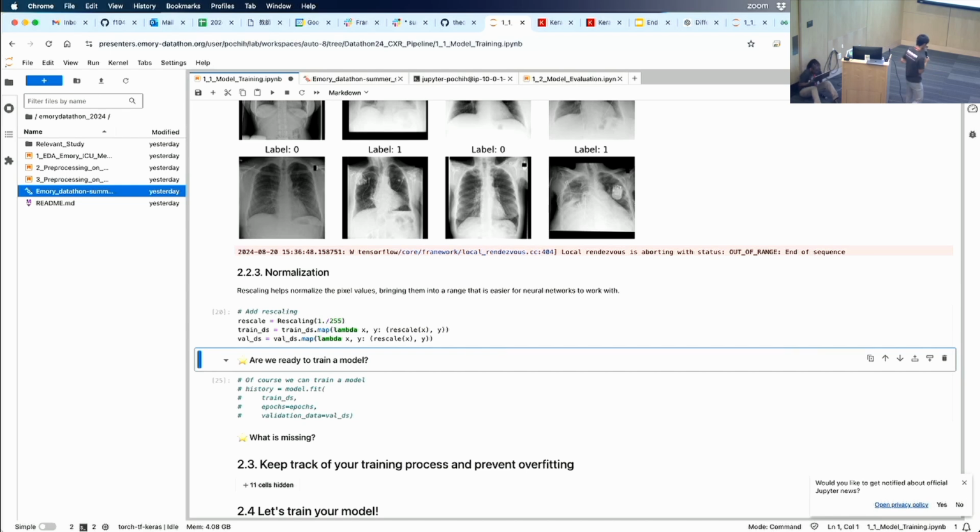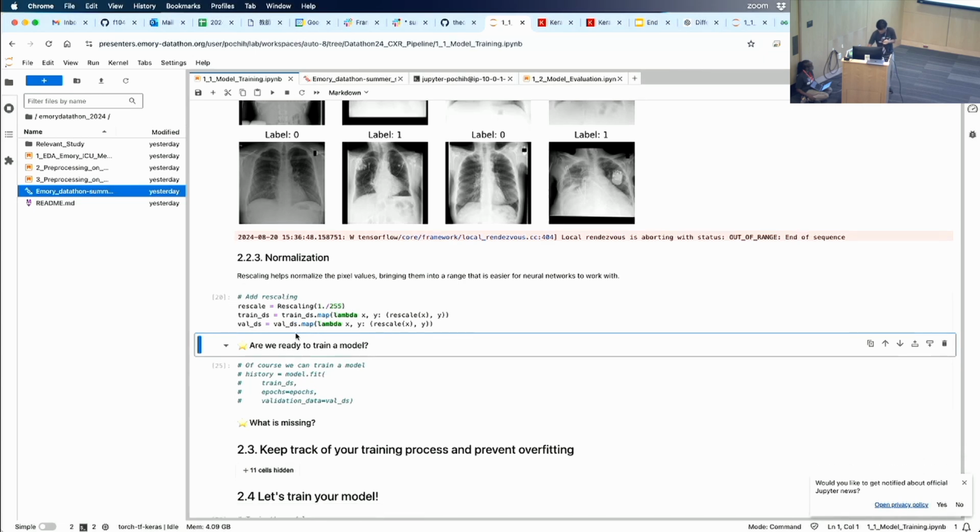I think the easy way to think about this is that our output is also 0 and 1, a positive or negative. During training, we do not want our model to learn very huge or very small weights because our input values are large, 200 something. So we make our input close to our output, 0 and 1. That's why we adjust our pixel values to between 0 and 1, and that also makes our training more efficient.